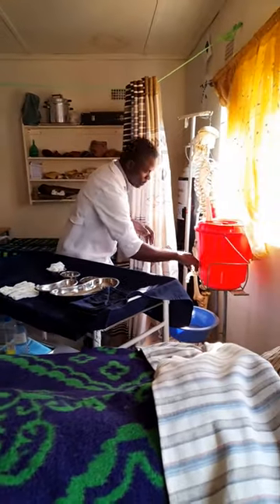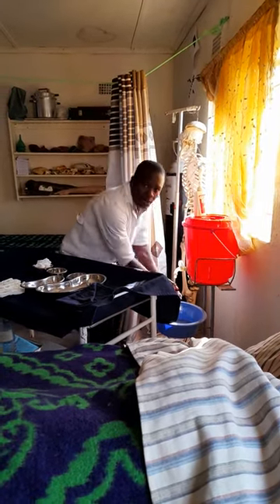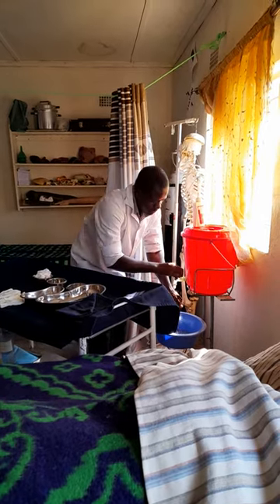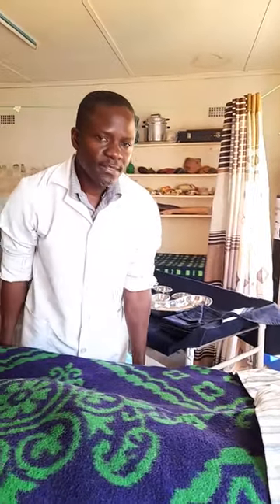To start, as usual, you have to wash hands. You need to do that. On the ward you have to be very fast so that you do the specimen collection quickly.